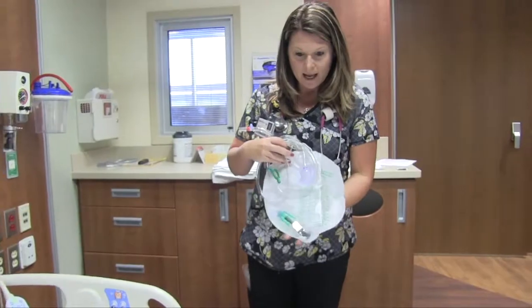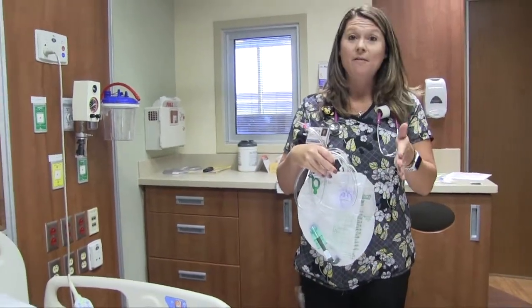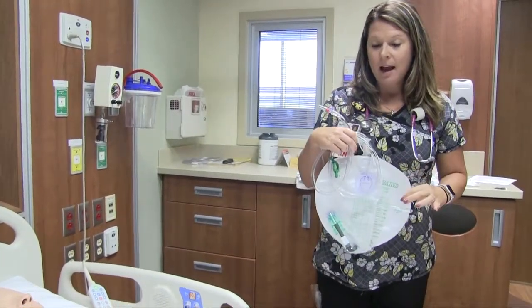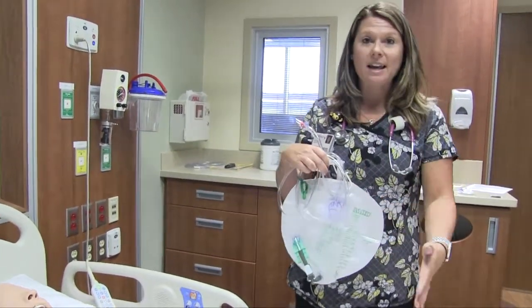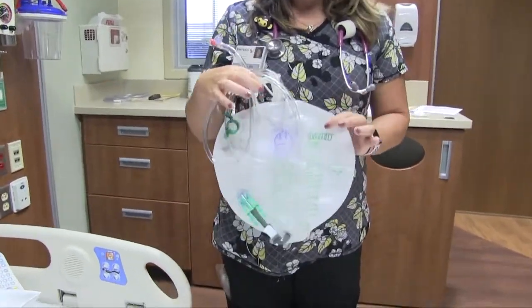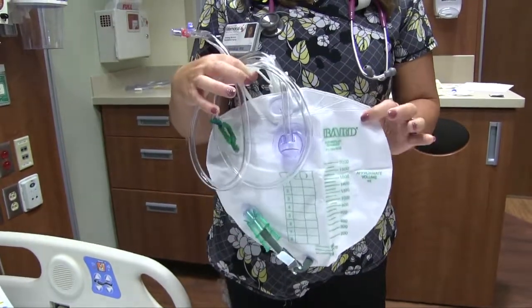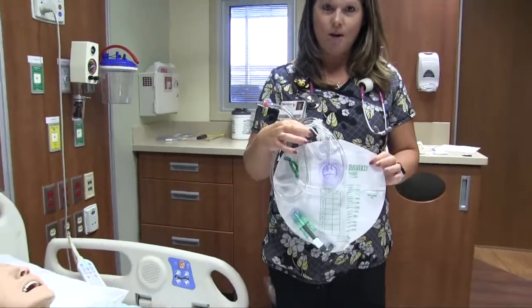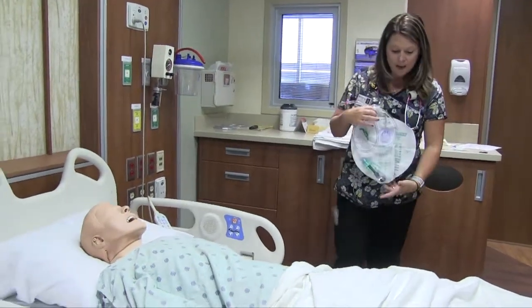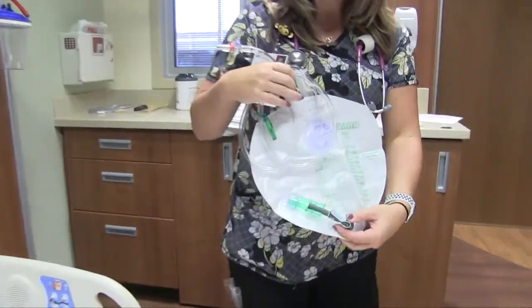So this is the bag that you need to have on if your feet are going to be above your waist. Your bladder is going to drain into this tube and it's going to follow gravity. So if you're sitting in your easy chair at home and your feet are up, this bag needs to be on instead of the leg bag I'll teach you about in a few minutes. But the first thing I want to show you is how you're going to empty this bag, okay?